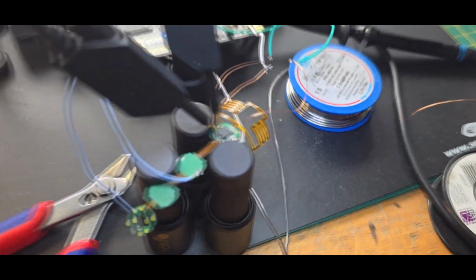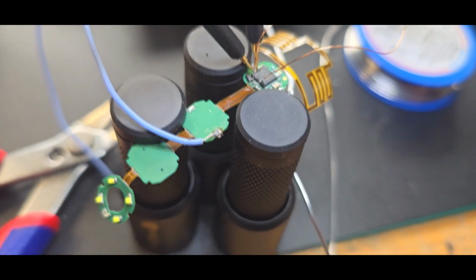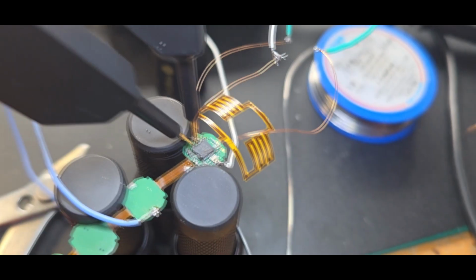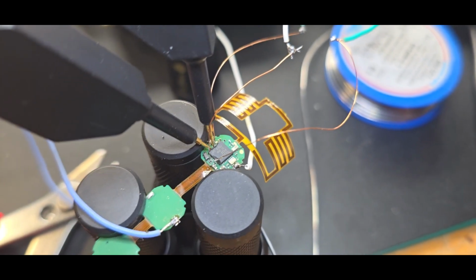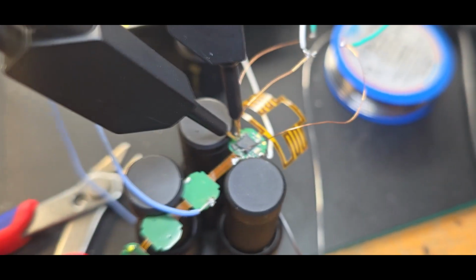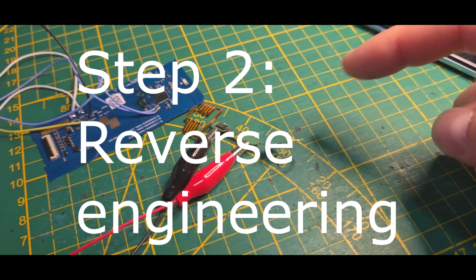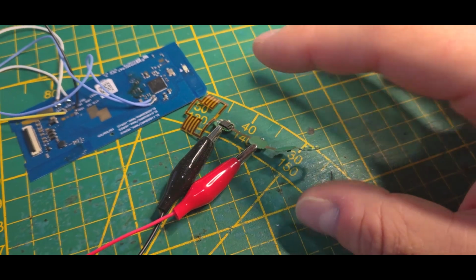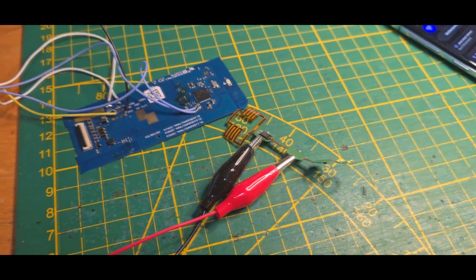This was a nice journey, and finally the Texas Instruments CC chips are under full control, I would call it, which now means every CC26xx and CC13xx and so on can be dumped, if not too new. Very nice. That's quite the step forward to a fully functioning camera. I mean, yeah, it's quite the mess right now, but it will get there at some point.